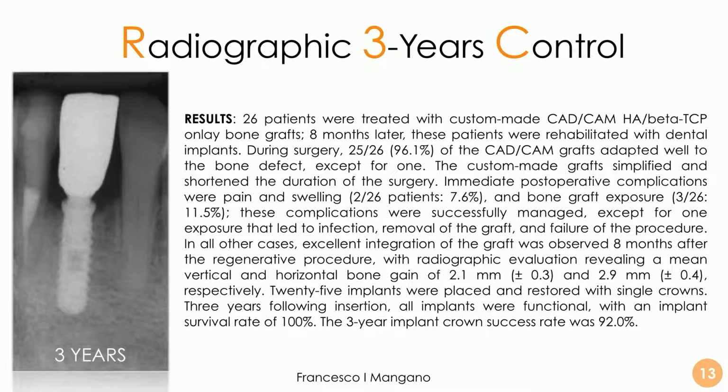So basically, in this study, we are willing to publish in the Journal of Dentistry. We have 26 patients treated with this protocol, and 25 over 26 of the grafts adapted very well to the bone defect during the surgery. Only one did not, basically because the segmentation was not performed well.